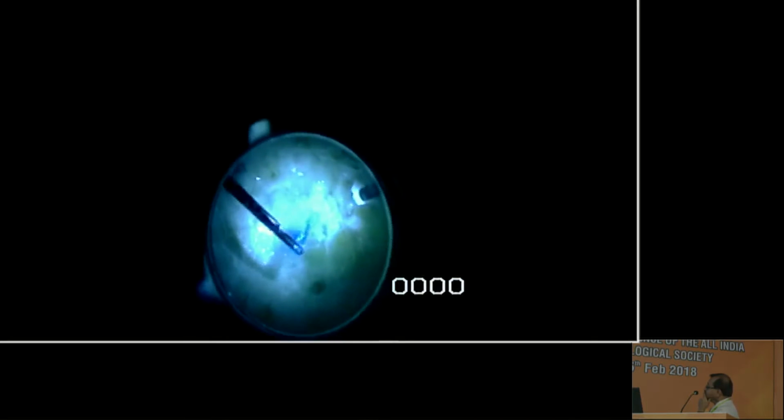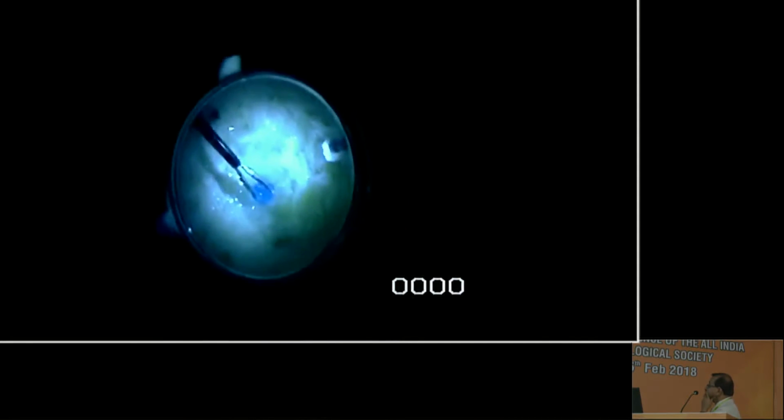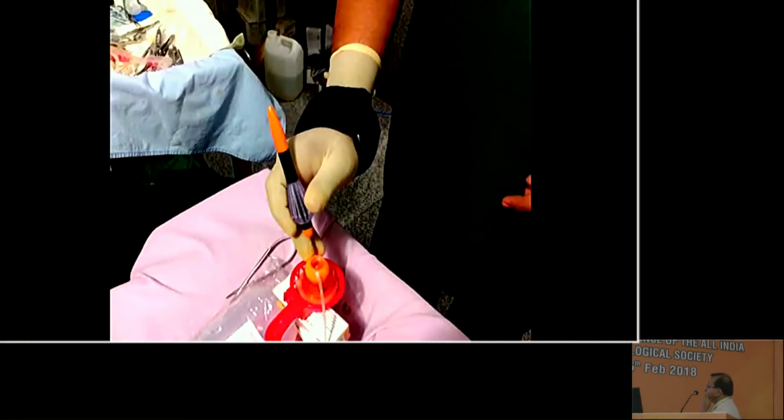This helps in depth perception and also helps refine movements involved in the delicate maneuver of ILM peel. A wrist weight or a wristband helps stabilize the wrist in this delicate maneuver for beginners.